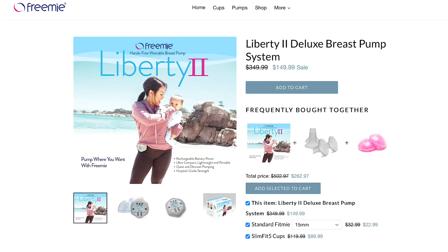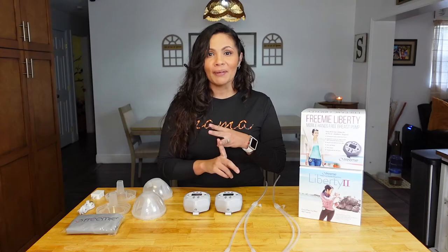Hey parents, if you've been following FreeMie, you can see that they have come out with three new pumps: the Independence 2, the Liberty 2, and the Rose Premium. I have recently reviewed the Liberty 1 and the Liberty 2, and now in this video I'm going to be comparing and contrasting the two.